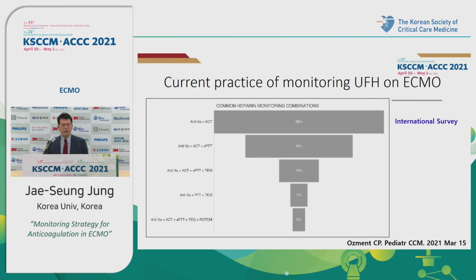This international survey shows the current practice of monitoring heparin on ECMO. About 70% of centers in the world are using an anti-10A and ACT combination. The second most common answer is to monitor anti-10A, ACT, and APTT together. Only about 15% of centers use TEG or ROTEM.